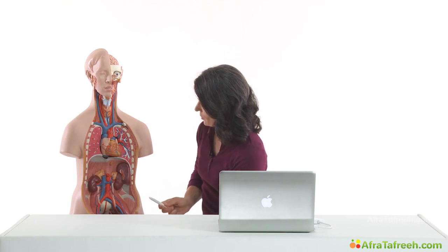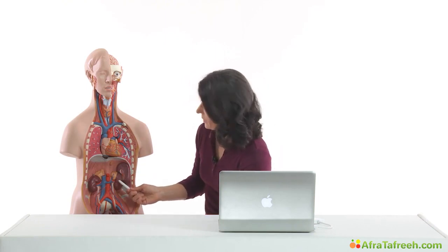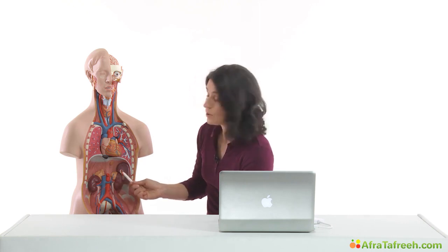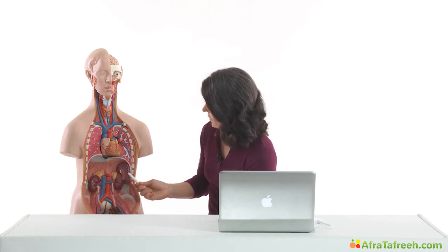Now let's go on to the left side. Of course, we got, again, the kidney, in this case, the left kidney over here. And another landmark for finding the left adrenal gland is the aorta over here. And of course, the spleen on the left side of the patient.